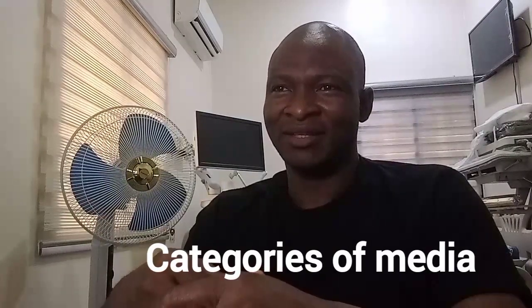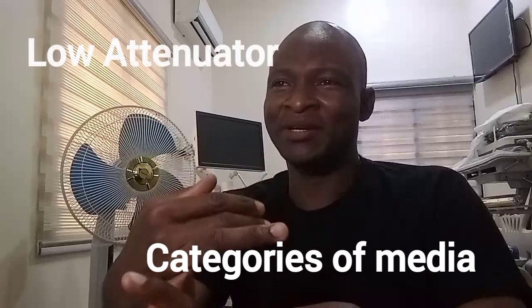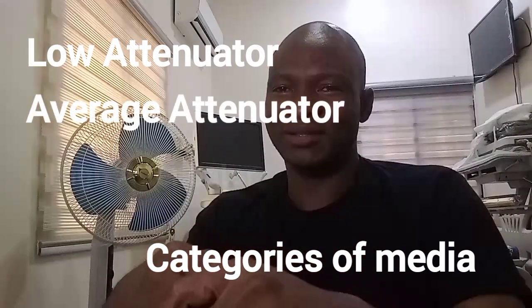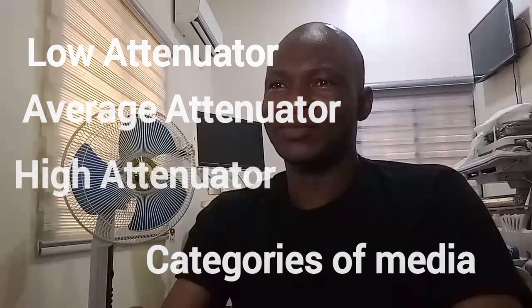There are categories of media. We have the low attenuating medium, average attenuating medium, and the high attenuating medium. As for frequency, higher frequencies are attenuated more than lower frequencies, while lower frequency will penetrate more deeply than higher frequency because they are attenuated to a lesser degree.